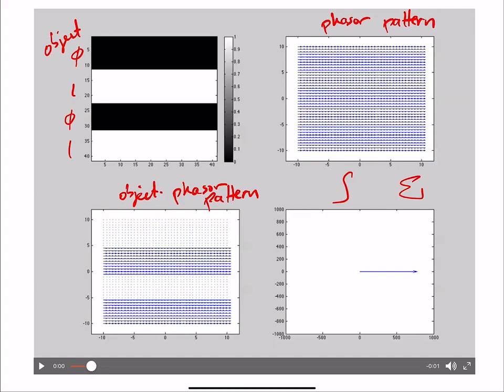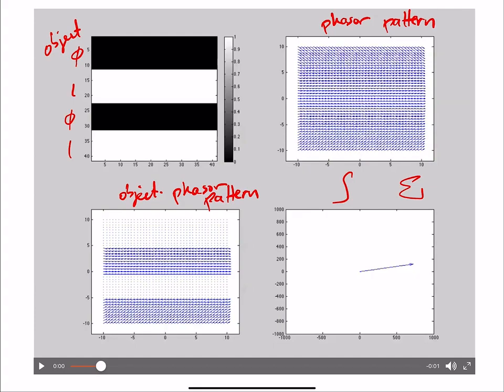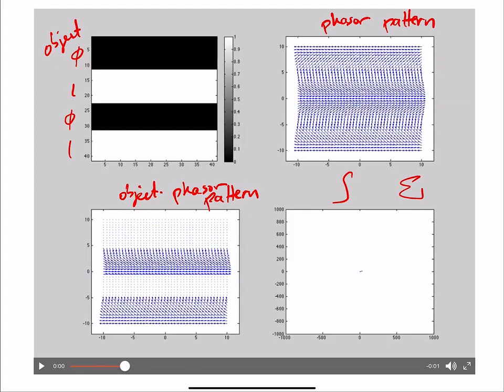Okay? As I get farther out in K-space, you notice that now the summation is very small. Okay, because I'm at a part in K-space where some of the spins, like all these spins, are pointing one way, and these spins here are pointing the other way, right? So they're canceling each other out. It's a little hard to see on this, but they're canceling each other out.